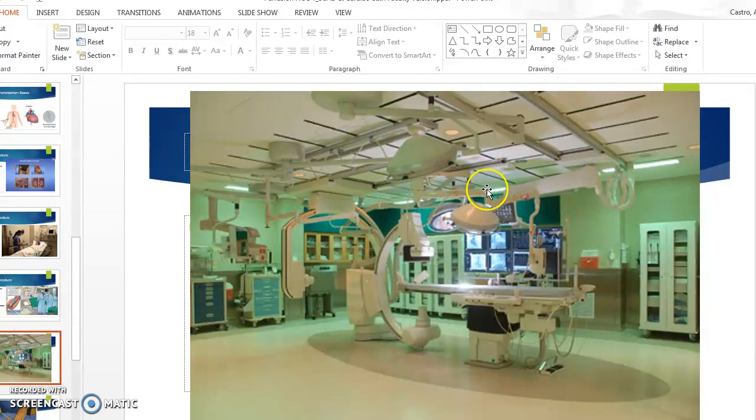And this one has these beautiful surgical lights as well that are focused right on where the patient's groin would be. All these cameras show all the different views of the heart so that they can be working in real time on their x-ray fluoroscopy video, and right next to it have a still picture of what they just took. Their monitors are here so they can see all the pressures that they're taking as they're taking them. It looks like they maybe have the patient's echo up there, so this is pretty sweet, pretty fitted up. Here's all their stents in here, and just different supplies. Looks like all stents in there.